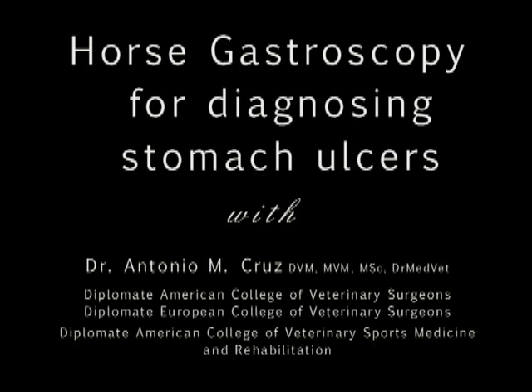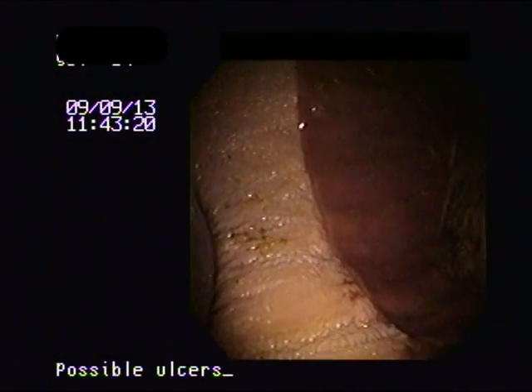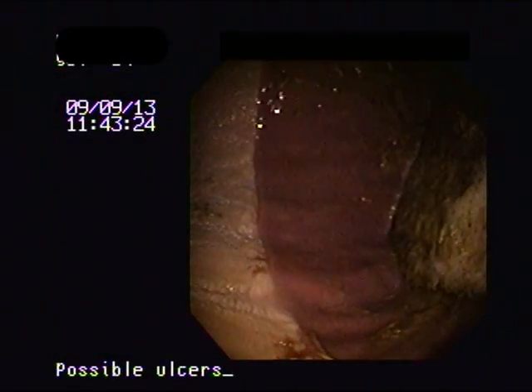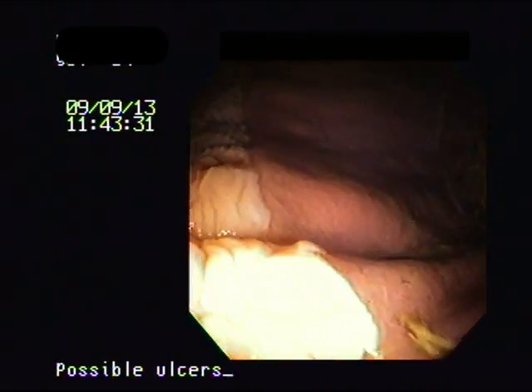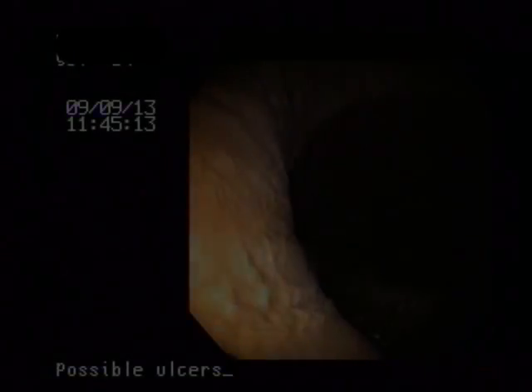Today we're going to show you a horse gastroscopy to diagnose stomach ulcers. This is the image of a stomach showing the whitish part which is called the squamous mucosa and the pink part which is called the glandular mucosa. The margin between both of them is called the margo plicatus. Most ulcers tend to occur around that location.